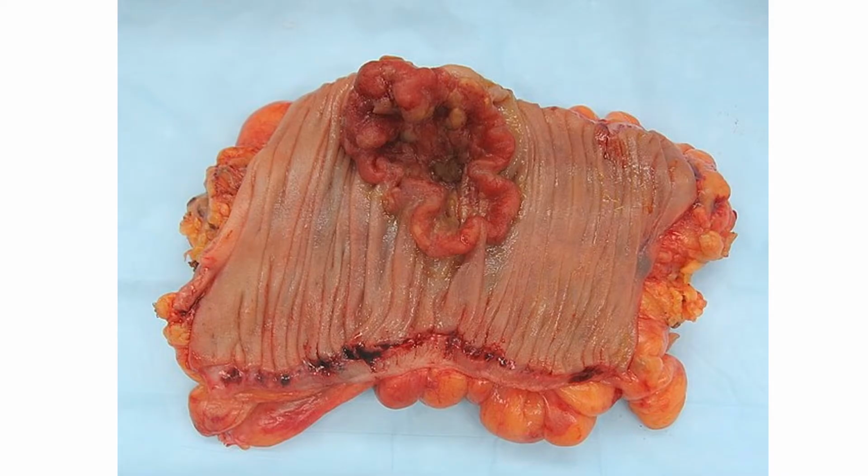The next one is colon adenocarcinoma or colon carcinoma. Again, this is also a tumor, right? An ulcerating tumor, and you can see there is a base which is necrotic and dirty with areas of hemorrhage and necrosis. And again, the margin is what we call elevated or rolling.